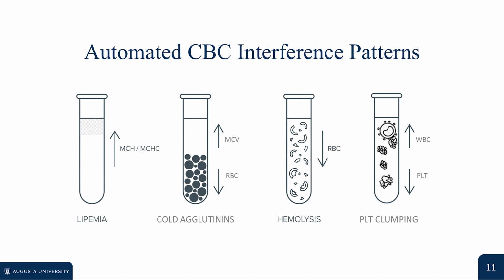Gross in vitro hemolysis involves pre-analytical lysis of red cells in the collection tube. The analyzer records a falsely low RBC count and calculated hematocrit, leading to spuriously elevated MCH and MCHC, even though the hemoglobin reading reflects true total released hemoglobin.